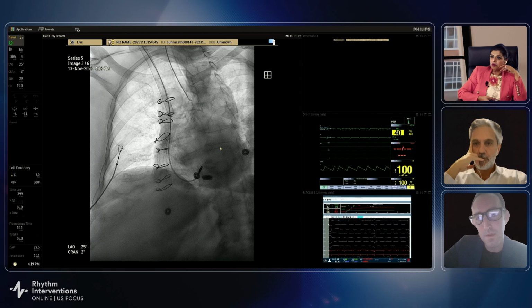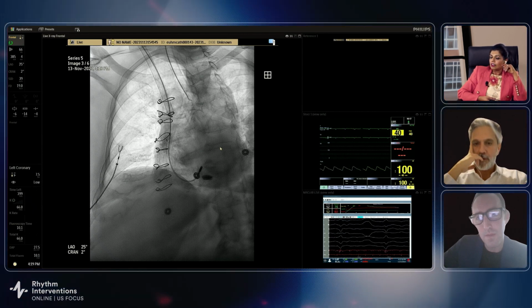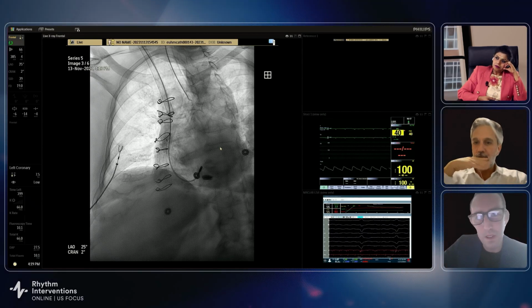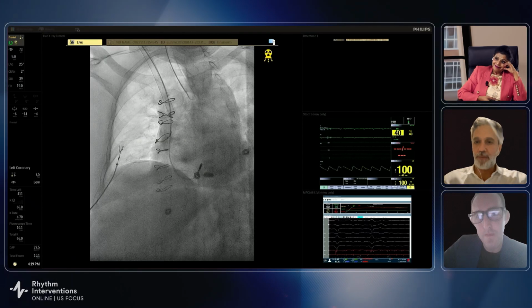So we started using Perclose for that, but still do the figure of 8 on top of that. What helps here, what's amazing, is you just pull the head at 45 degrees, and that will also help hemostasis because it drops the venous pressure. With a micro, the patient basically can walk off the table after you just hold a little bit of pressure by the neck.